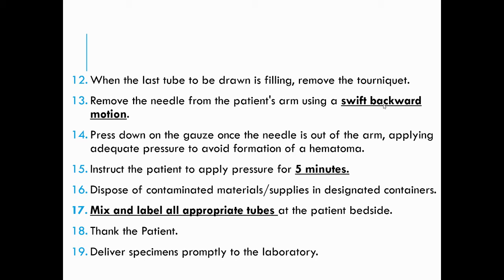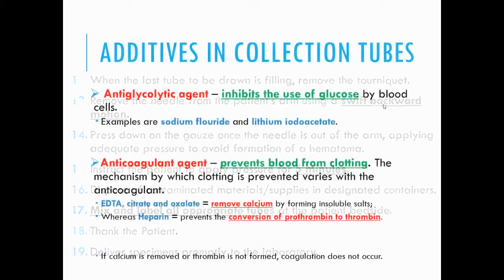Apply pressure, and inform the patient to apply pressure to avoid hematoma. The duration of applying pressure is 5 minutes. It should not be you but the patient, and dispose of all the materials in their designated containers. And again, make sure you mix the tubes properly, with the required number of mixes for the different tubes, and that the tubes are labeled properly. We need to thank the patient and deliver specimens promptly to the laboratory.